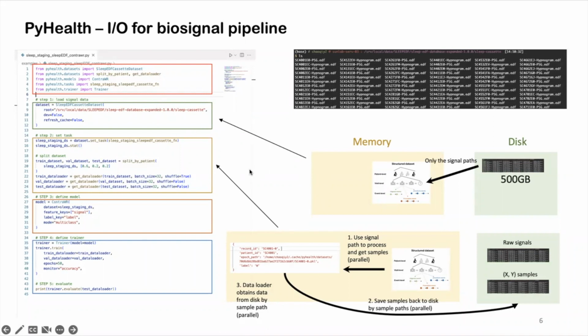Yeah, the other part, this is very easy to add, but probably necessary for a real application. That is the timestamp of those samples, right? When you split this recording, I assume in the EDF file they have some timestamp? I think the timestamp will be similar to the segment ID in that long recording. Right, so there's some logic you have to provide.